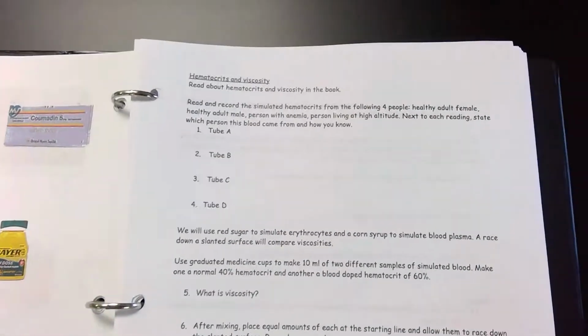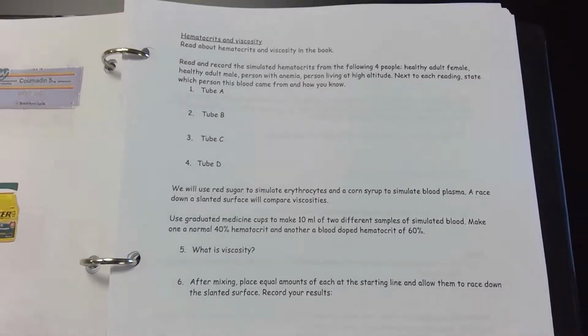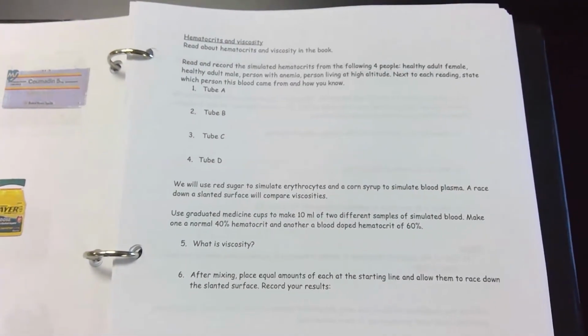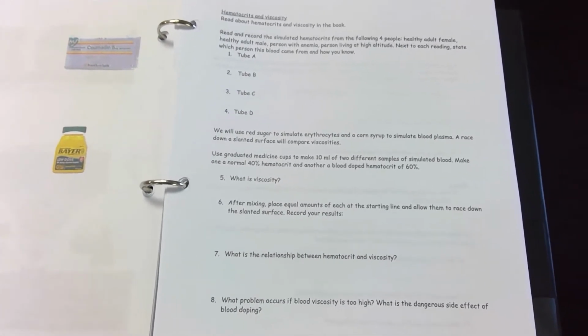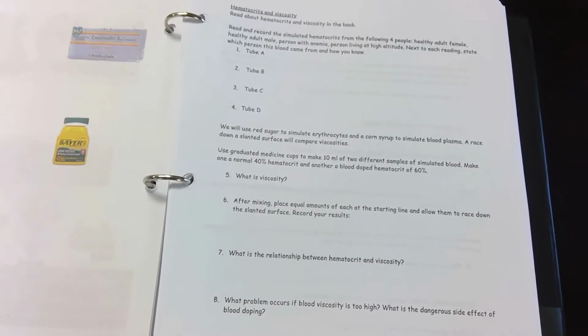The first part of Chapter 18 Lab is about hematocrits and viscosity. Make sure you read the section in the book about hematocrits. This is in the beginning of the chapter where it talks about blood composition. Remember, blood is number one, plasma. That's the most abundant thing in blood, which is the liquid part.